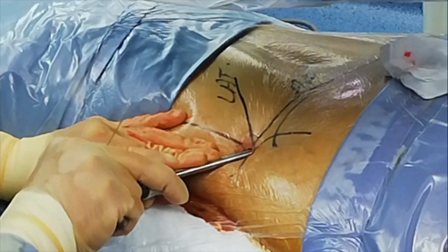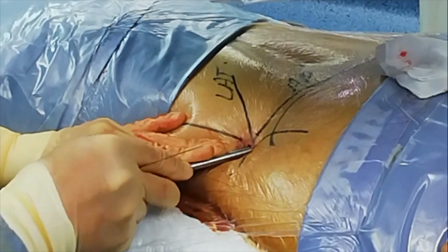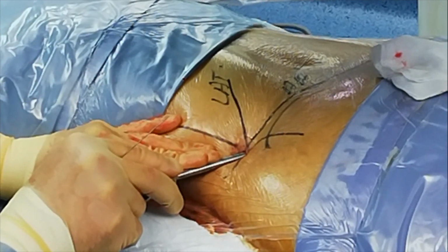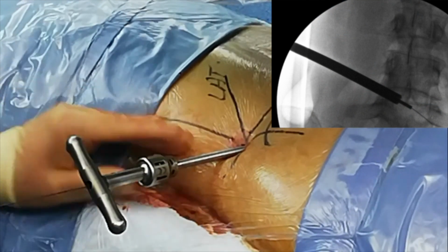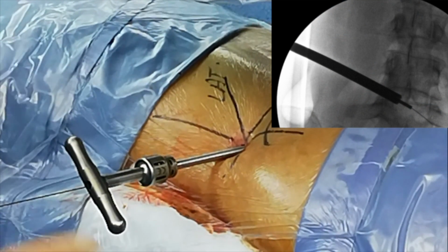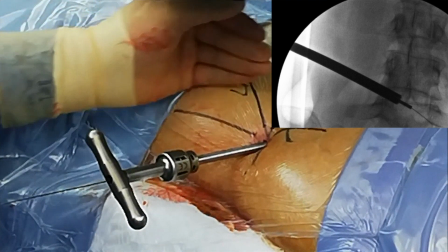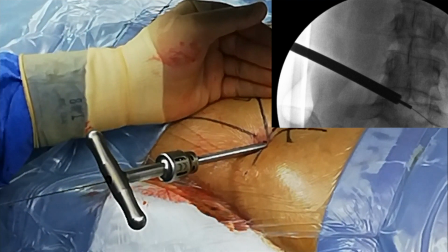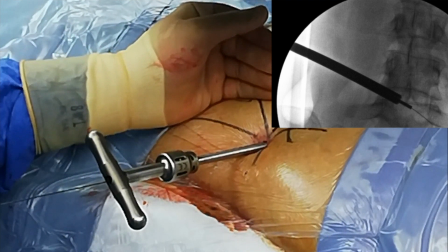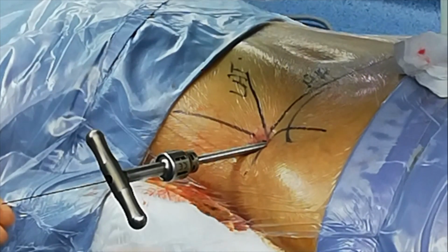Okay, so remember, the bigger reamer sometimes goes in much easier, so very, very carefully. X-ray, please. And that's it. You see, only a couple of turns, and because she's young, it's a big foramen, so reaming is on the AP, and you are allowed to bypass the medial pedicle wall for L4-5, L5S1 by 2 millimeters only, because beyond that is where the shoulder of the traversing nerve root is. So be very careful with that. So we're done with the reaming.